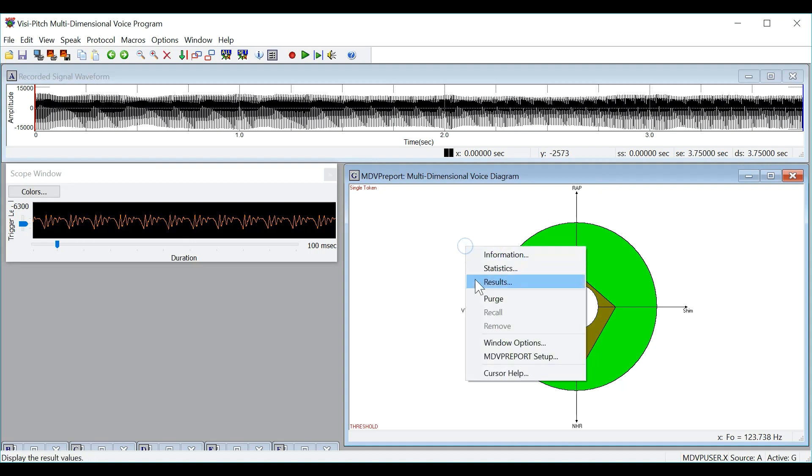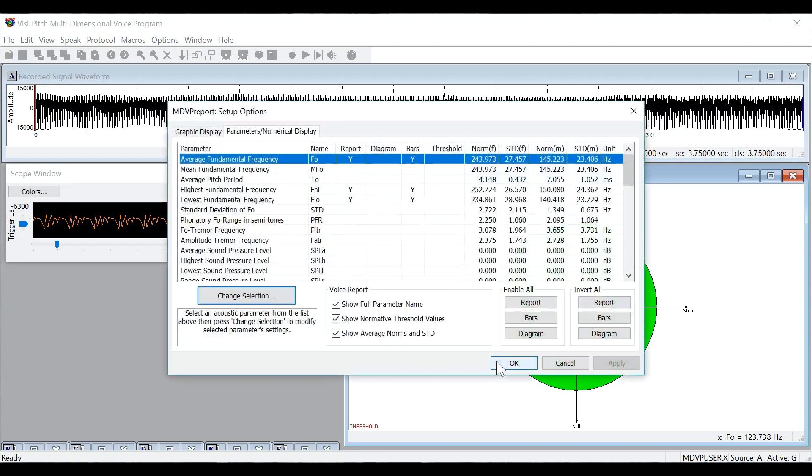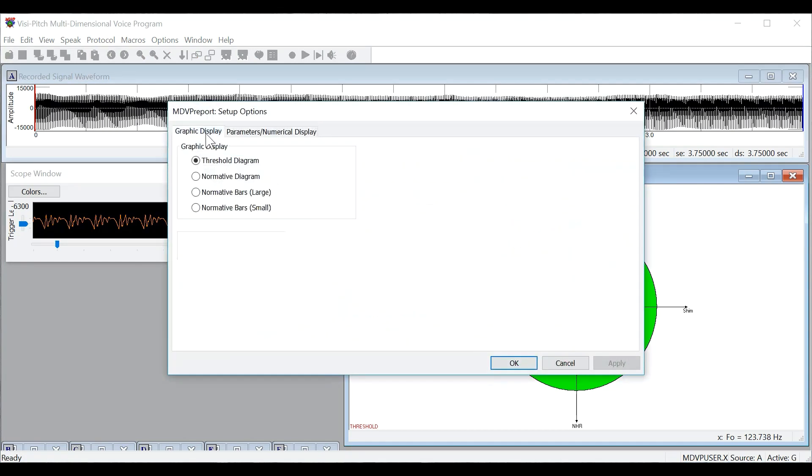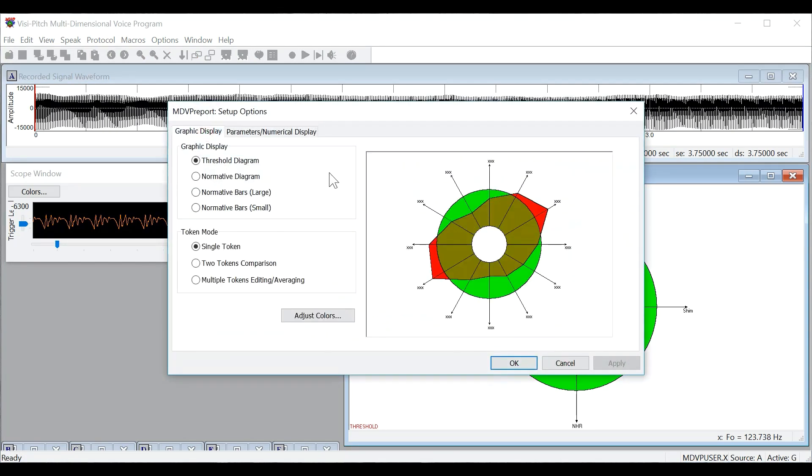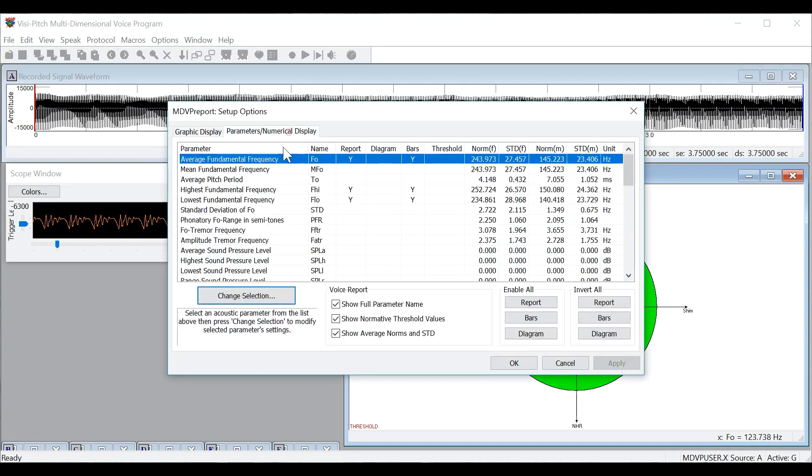You can also right-click and go to MDVP report setup to change the type of graphical display, as well as the parameters that show up in the analysis.